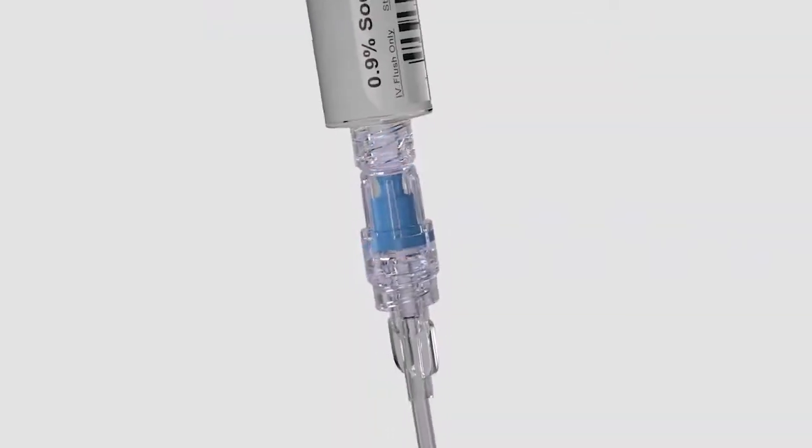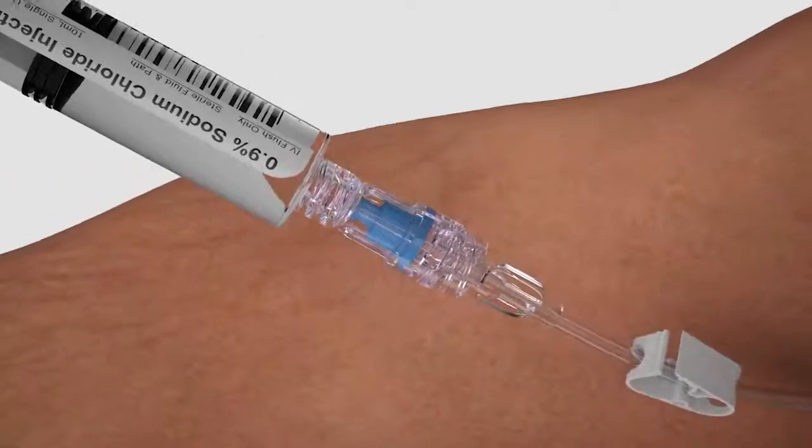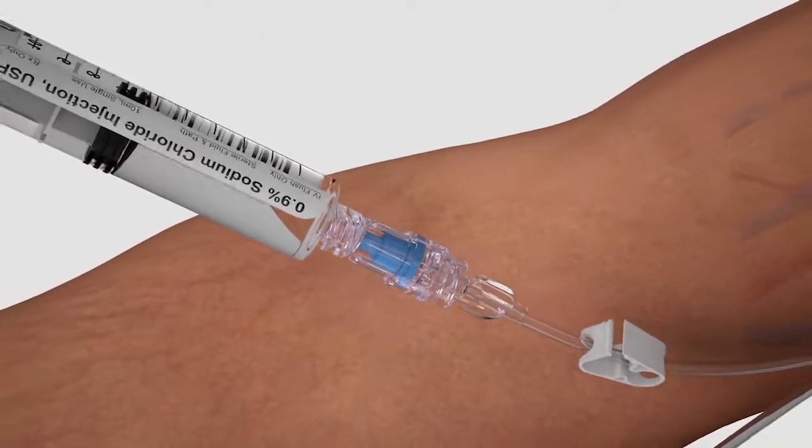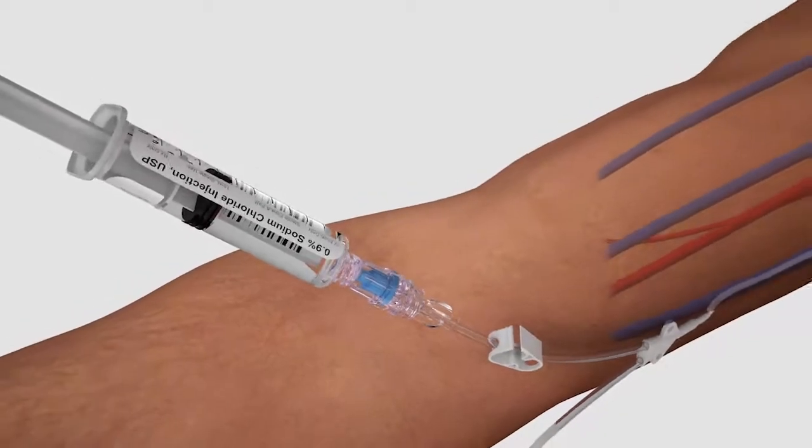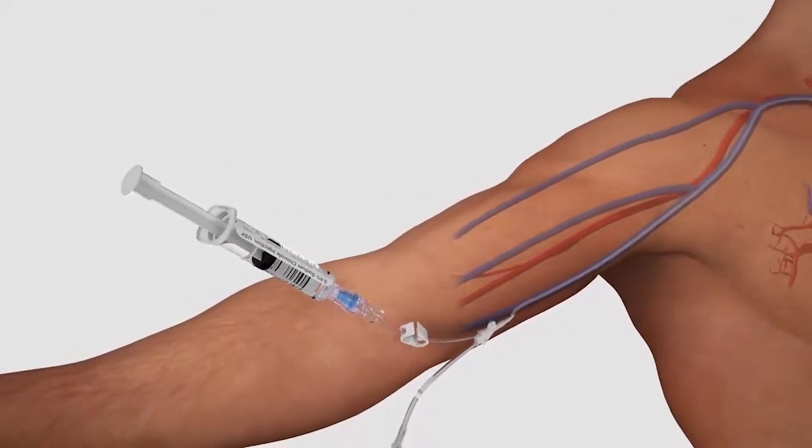While a needle-free connector is a relatively small medical device, the implications extend far beyond the device itself. It is clearly understood that connector design plays a significant role in three key areas as they relate to extended catheter dwell time.